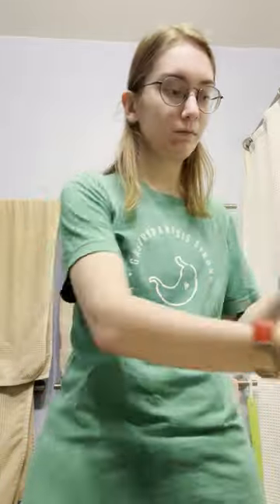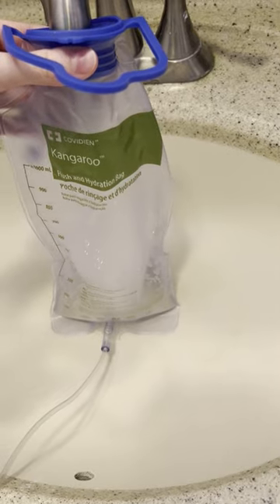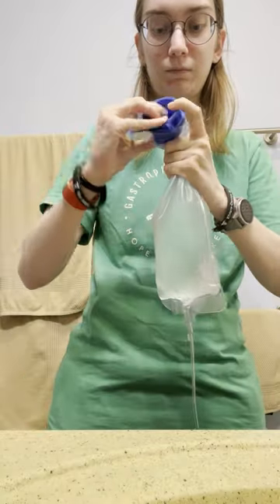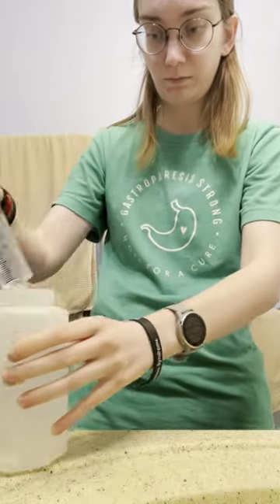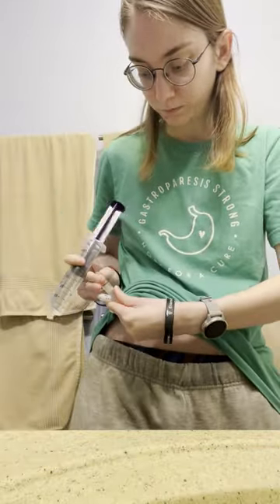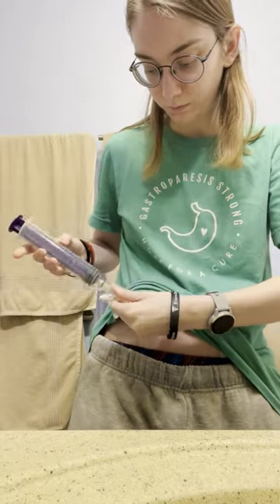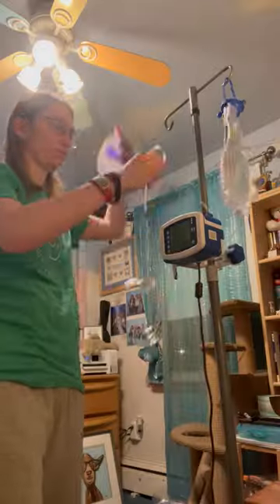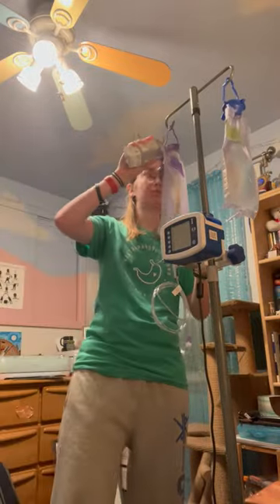The first thing I do is open up my feed and flush bag pouch. I open up the flush bag and fill it up with water. I'm allowed to use tap water — use whatever your doctor tells you to do. Next, I flush my tube with about 60 cc's of water. This makes sure that if any formula residue is still in my tube, it gets cleared out before I add new formula.